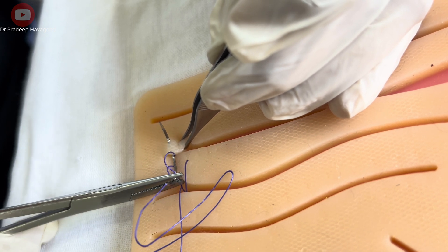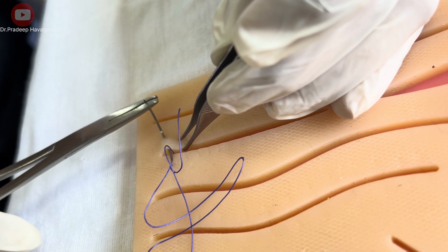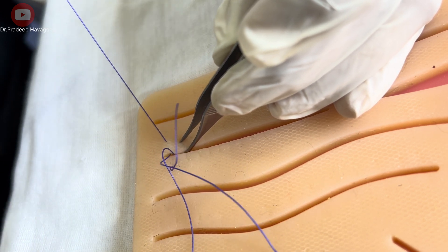Now, you are seeing this is the short end of suture and long end of suture. The first stitch should enter about 3-5 mm away from the wound edge and exit on the opposite side at a similar distance.